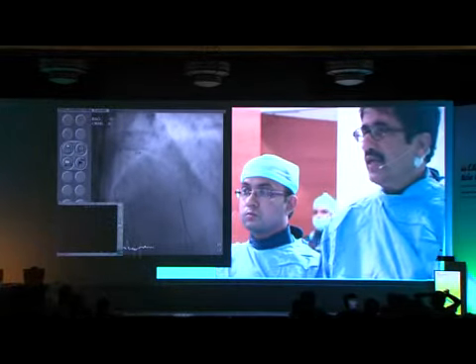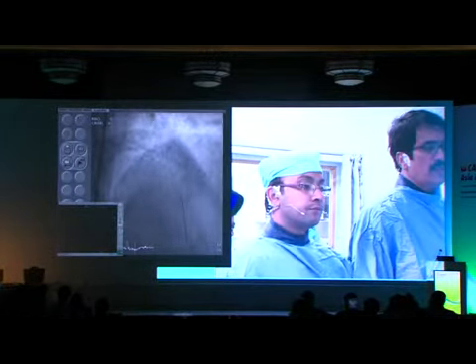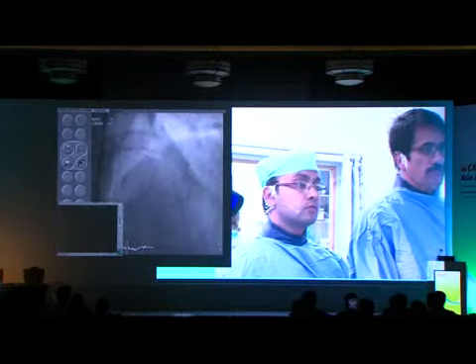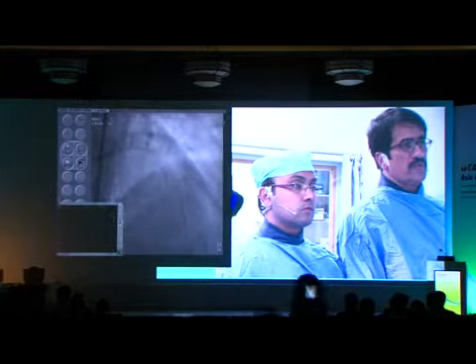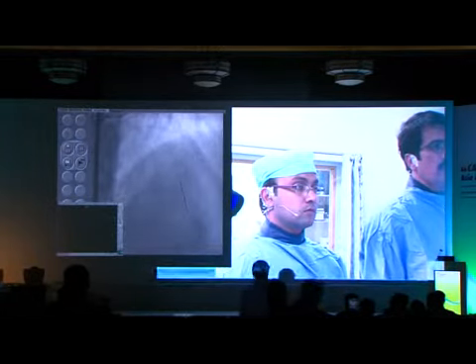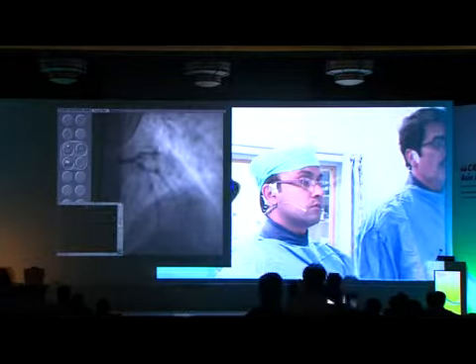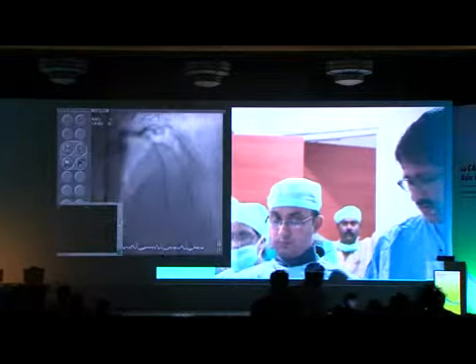Then we come in with a balloon by the company itself, and we go high pressure on that. Show the images after that. And the same is done to LAD. Let's jump some sequence, and we'll show you the current picture. Let's take contrast. What was the size of the second balloon in the diagonal, the diameter? We have used 2.5. So now we are ready, open the stent.